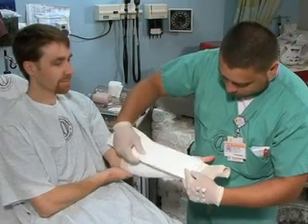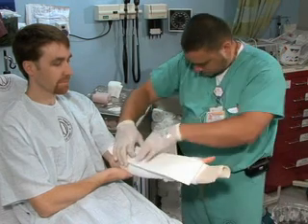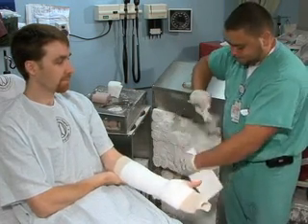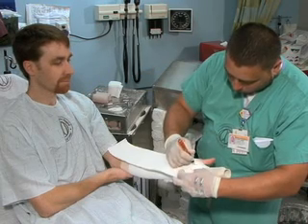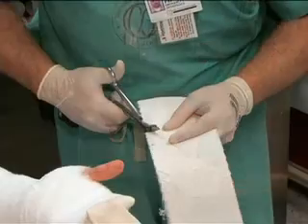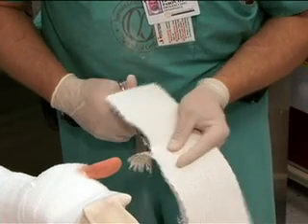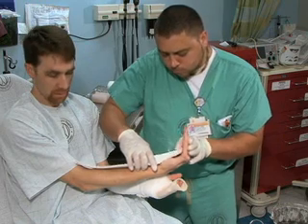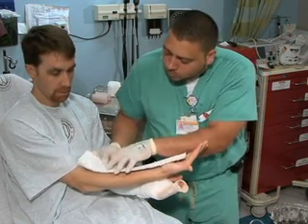Select a piece of dry plaster that is slightly wider than the limb to be immobilized. Measure the length of the splint material required and then cut or tear the dry plaster material to the appropriate length. Use at least 8 layers of plaster material for upper extremity splints and 12 layers for lower extremity splints to provide adequate strength to the completed splint. Consider using the unaffected extremity to measure the length of plaster that will be needed to limit the discomfort caused by moving the injured limb.